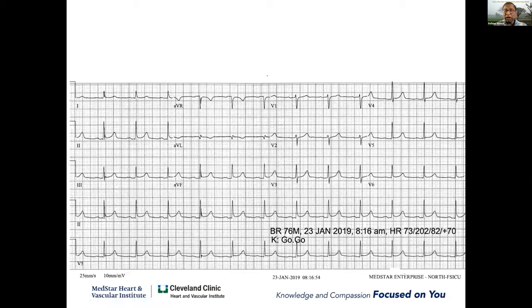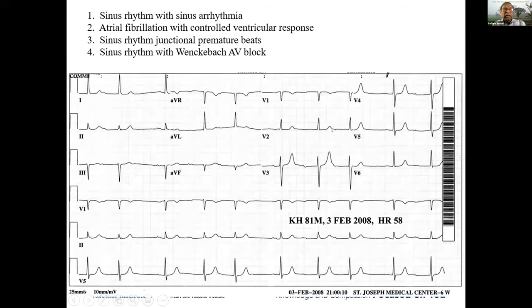So this is again the potassium; when the same patient's potassium becomes 5.5, you can see the P wave now coming up here, with a QRS complex much narrower than before. Okay.